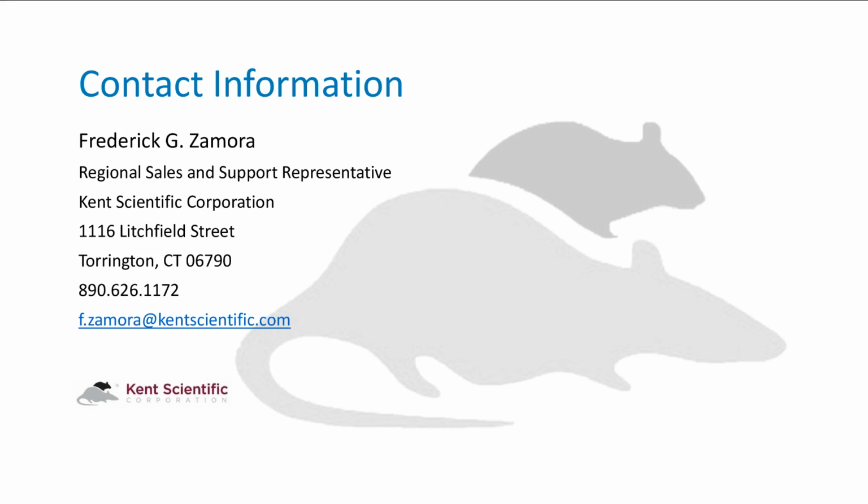Yeah, definitely. Okay. This is a long question from Patrick. So if ambient air is used as a carrier gas, is there any connection necessary, or does it just use air from around the device? So we'll start with that one. Hello, Patrick, by the way. If ambient air is used as carrier gas, is there any connection necessary?